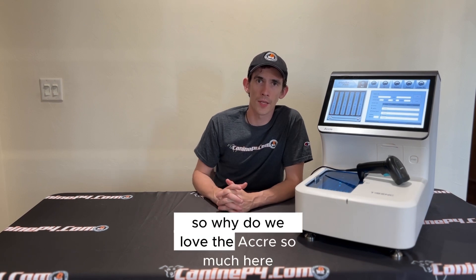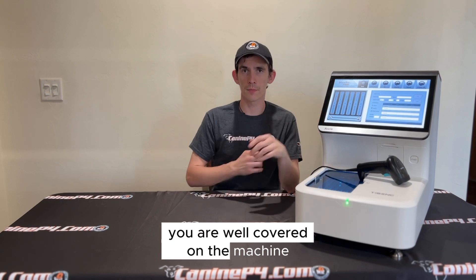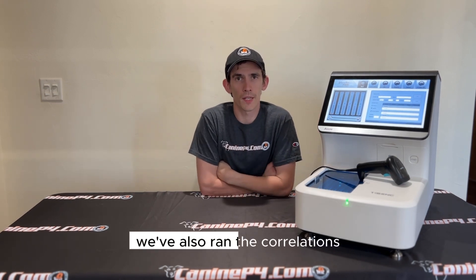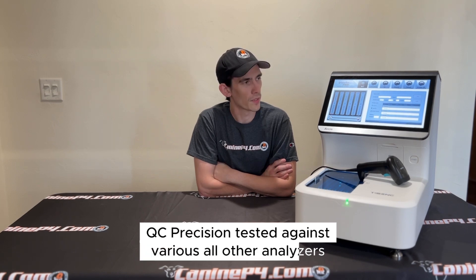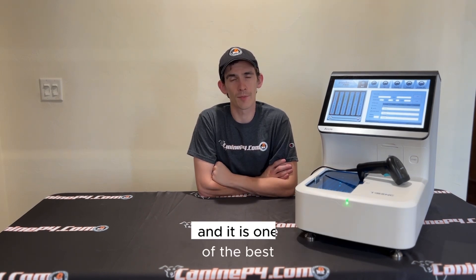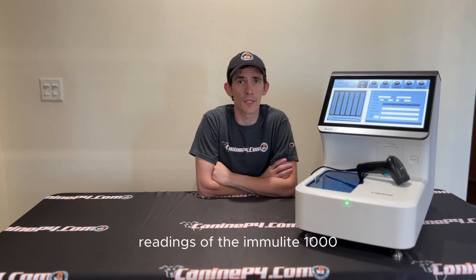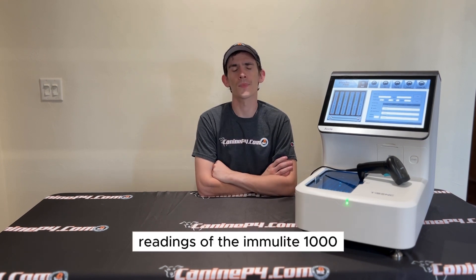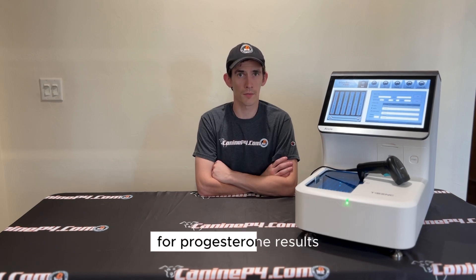So why do we love the Accre 8 so much here at CanineP4? With the replacement warranty, you are well covered on the machine. We've also run correlations, QC, and precision tests against various other analyzers, and it is one of the best in terms of gold standard method readings of the Immulite 1000, which are very close and similar to literature values for progesterone results.